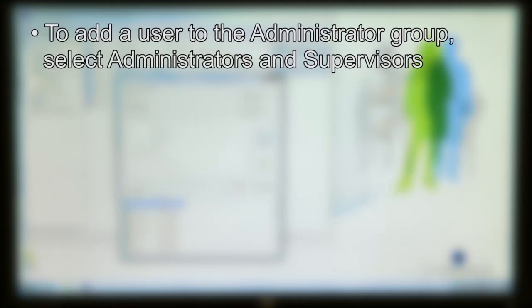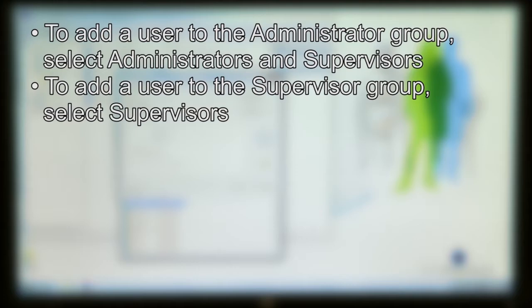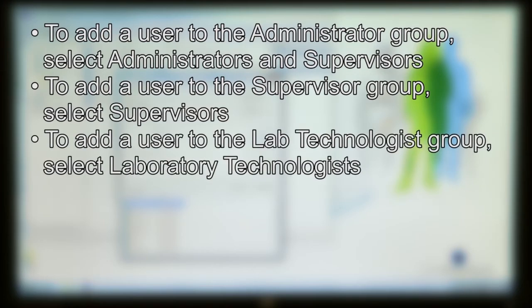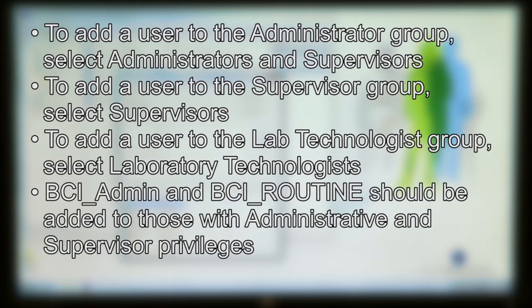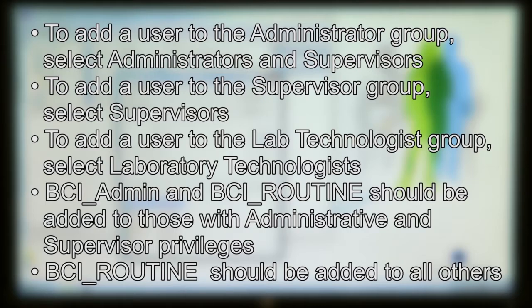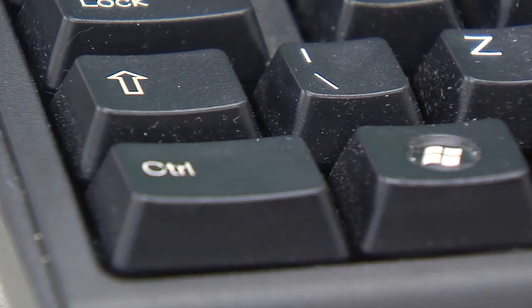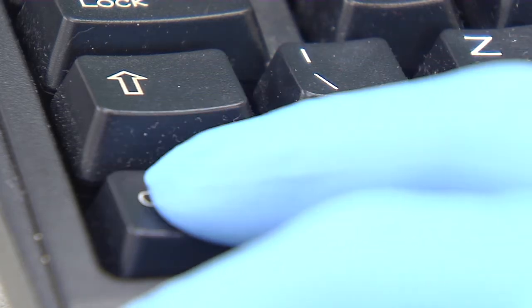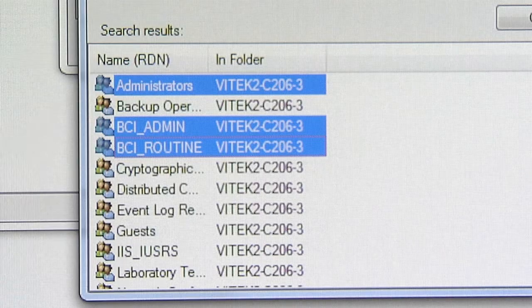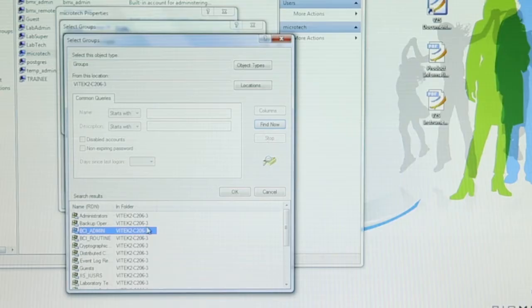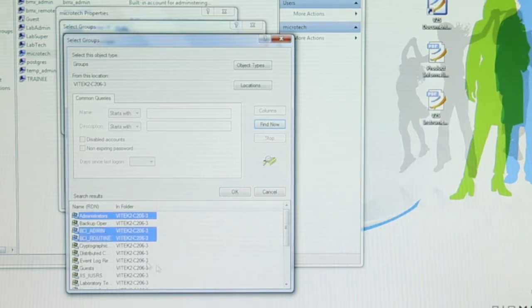To add a user to the Administrator group, select Administrators and Supervisors. To add a user to the Supervisor group, select Supervisors. To add a user to the Lab Technologists group, select Laboratory Technologist. BCI Admin and BCI Routine should be added to those with Administrative and Supervisor privileges; BCI Routine should be added to all others. To select more than one security group, hold down the Control key on the keyboard and click the desired groups. For our example, Microtech will be assigned to Administrator, Supervisor, BCI Admin, and BCI Routine.